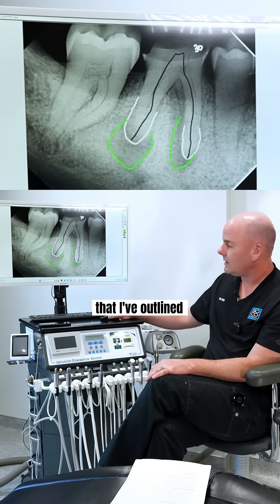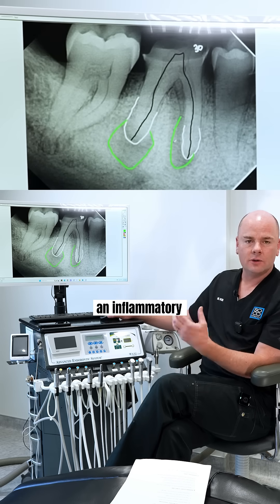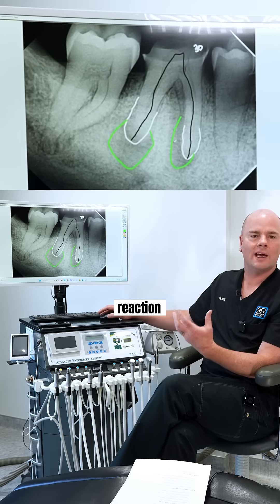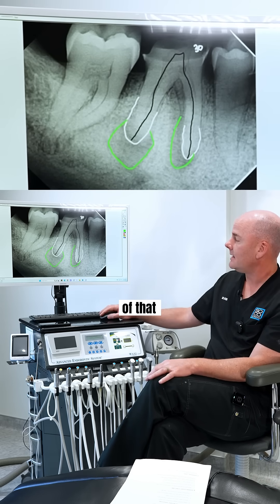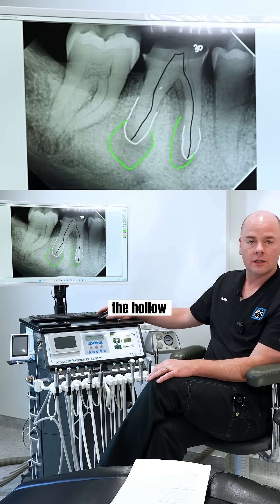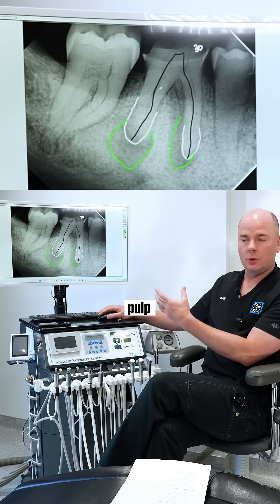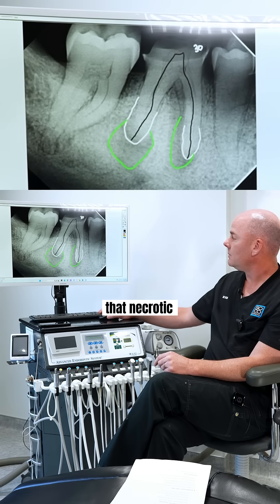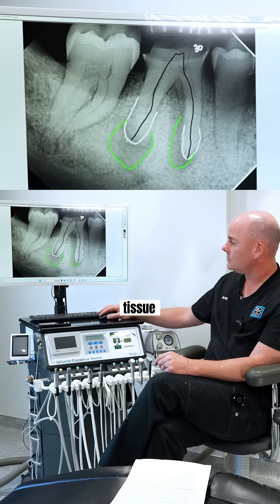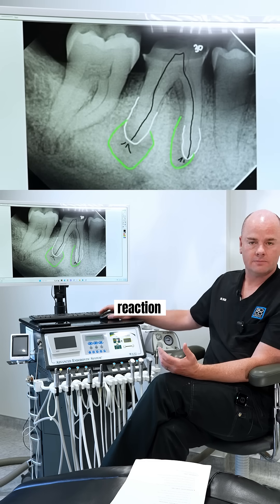These dark areas that I've outlined here in green — that's an inflammatory or infectious reaction, and the source of that is coming from inside the hollow canal represented in black. That pulp has died, and that necrotic pulp tissue is sourcing that inflammatory or infectious reaction.